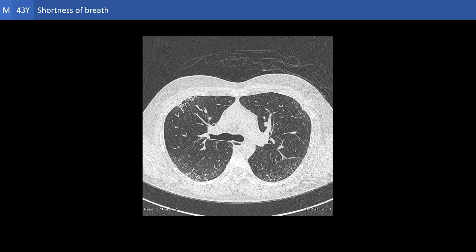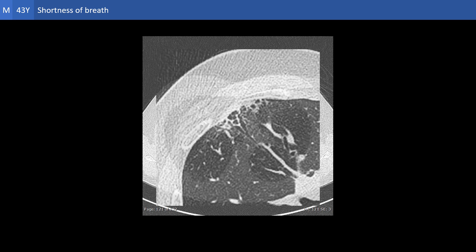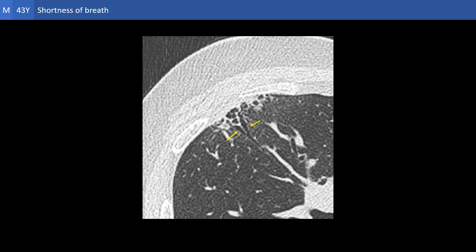What is seen here is the last form — the dilated bronchioles identified at the periphery of the lung. These findings help us recognize the rather subtle form of cylindrical bronchiectasis, for which we have to actively search, unlike the cystic bronchiectasis, which is easier to see.